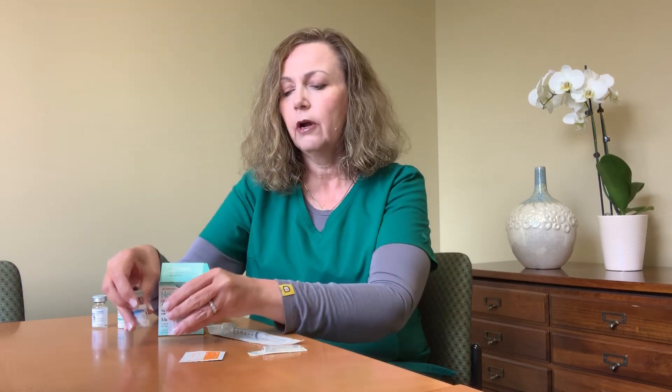If your dose is 2,500 international units of HCG and you have the Novaril, then you only need one box. You are going to draw up two milliliters of normal saline and inject the two milliliters into one 5,000 international unit vial and mix it up really well. You only need to withdraw one milliliter for your dose — so two milliliters of diluent into the 5,000 international units, but we want only half of that. Just withdraw one milliliter of the contents to administer for your trigger.